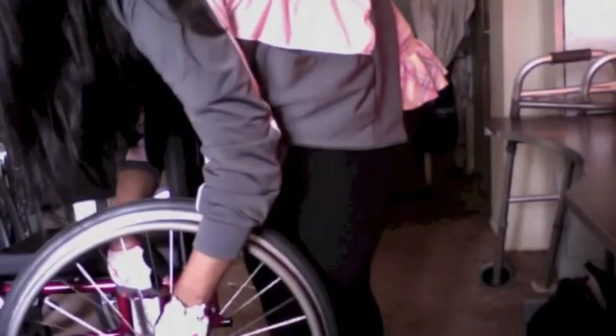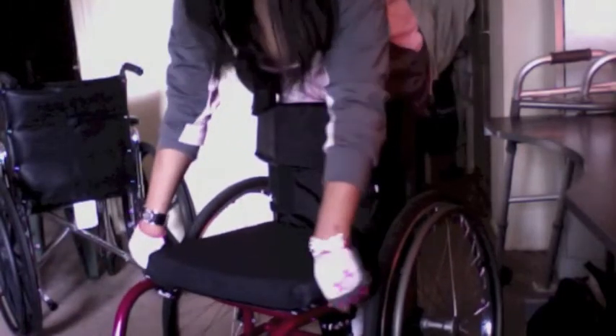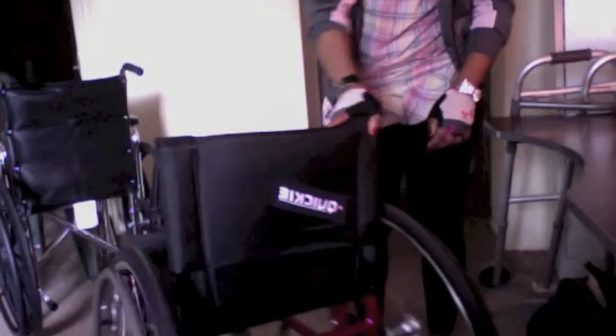It's very easy to attach — you hear that click — stick the wheel in and it's stable. You want to make sure that it's stable and not going anywhere. You have your option of wheel locks. I have my full back. It's totally up to you. I love this chair — it's perfect for my lifestyle, perfect for me.